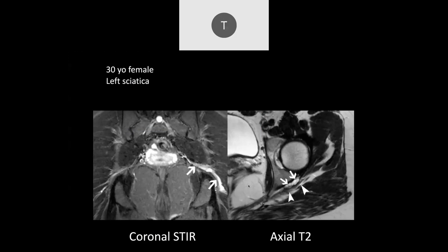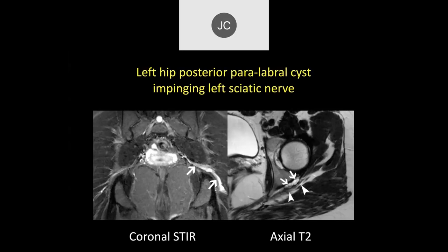Danny — looks like a paralabral cyst but I don't definitively see a tear. This is a situation where we're not seeing the labrum very well, but we see a cyst immediately adjacent to the posterior labrum. The patient has sciatica, and this cyst is right by where the sciatic nerve passes — it's actually compressing the sciatic nerve, producing sciatica. These posterior labral tears, though uncommon, can be a cause of sciatica due to compression of the sciatic nerve.